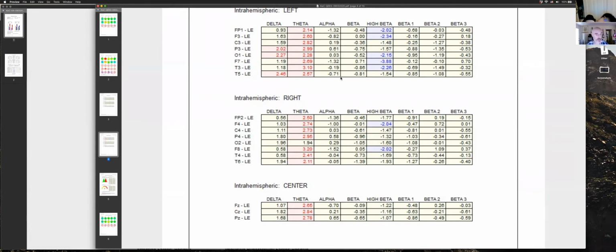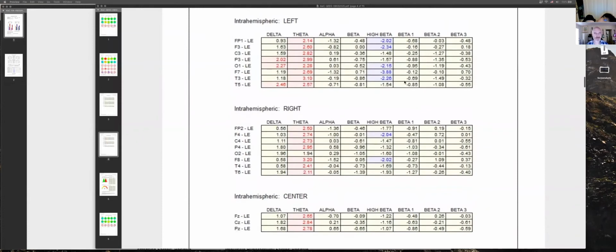But the fact that it's running slow suggests you aren't feeling very fast these days. You're feeling like you're dragging. And you may even be having some difficulty with your speed of processing when you're tired. And that would show up with things like difficulty with word finding. Hard to pull words out of your mind when you're tired. Yeah, I'm tired a lot. Is it hard to verbally produce quick words or remember names or objects, delayed recall for things verbally or not? Sometimes delayed recall. I'm better in writing than in person. Cool. Makes some sense. The verbal stuff tends to be more time bound and writing does not. So that makes some sense.